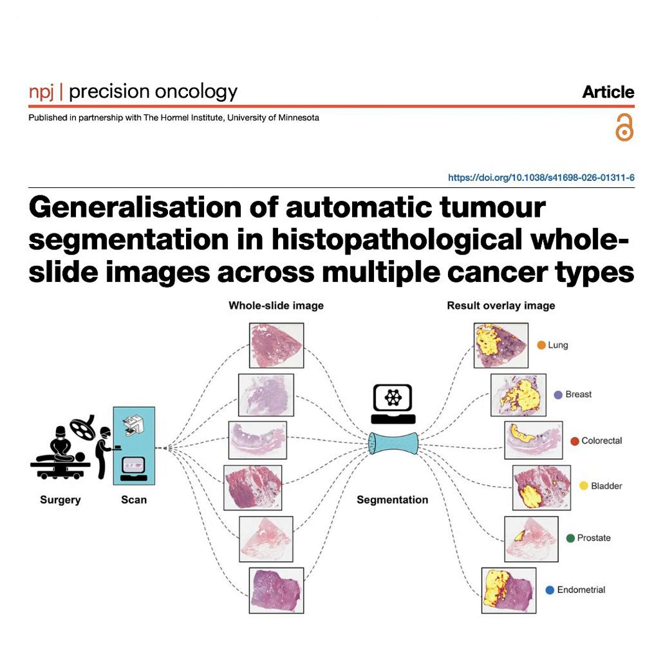It really is. Let's synthesize all of this. Yep. We started with the massive bottleneck in pathology. Millions of slides. Not enough doctors to review them. Yeah. What this study definitively proves is that a single pan-cancer AI model can successfully identify tumors across multiple organs. It proves that despite how differently a lung tumor and a breast tumor behave clinically, they share universal visual signatures at a microscopic level that a neural network can actually isolate.